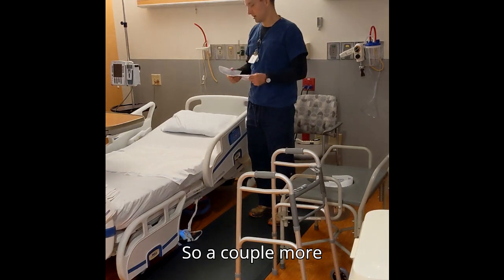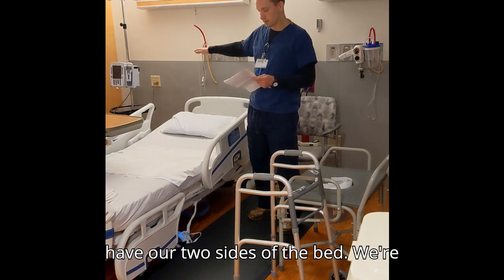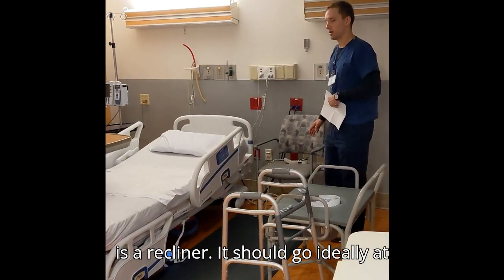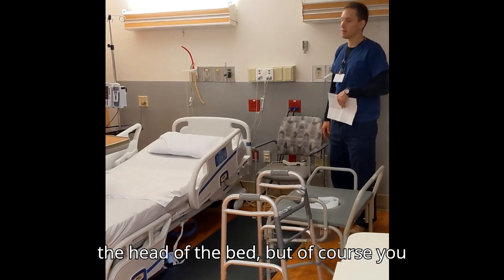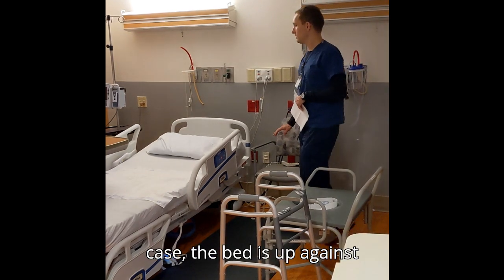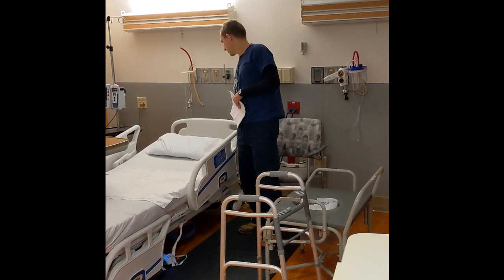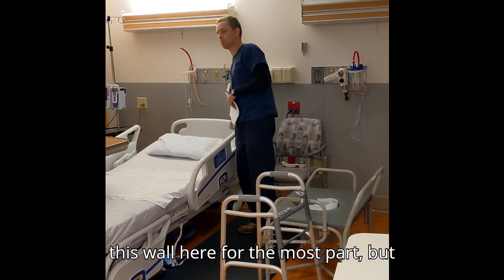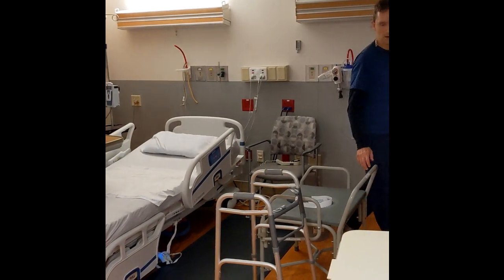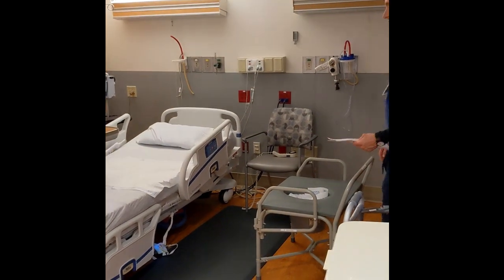So, a couple more considerations. Like I said, we have our two sides of the bed. We're going to pretend that this chair is a recliner. It should go ideally at the head of the bed, but of course you can move it around as needed. In this case, the bed is up against this wall here for the most part, but let's say for whatever reason it made sense to move this bedside commode table down.